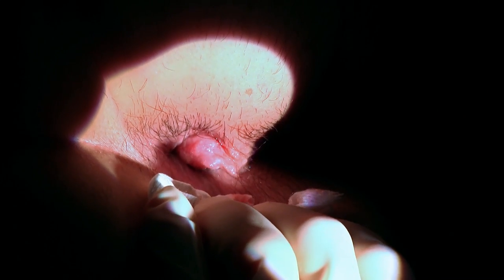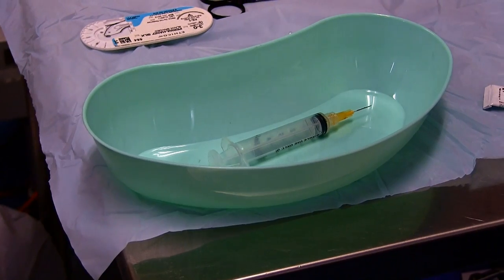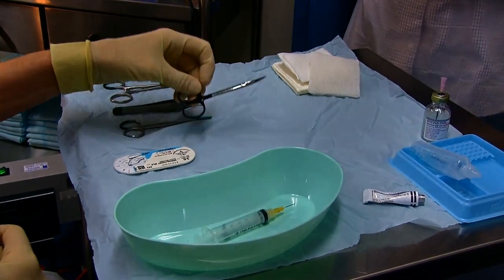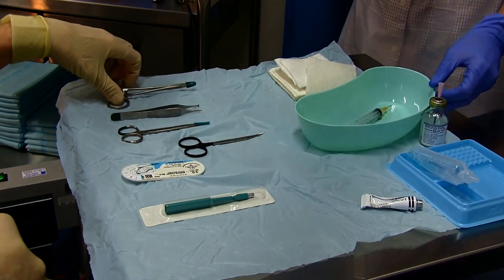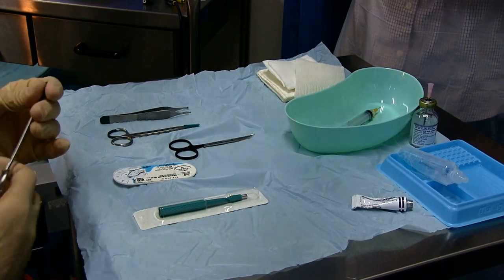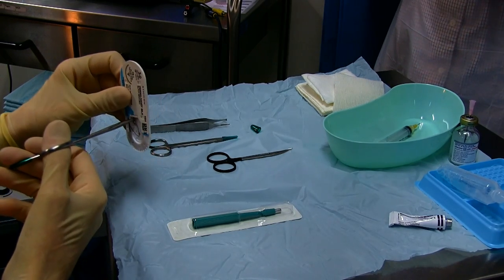We'll leave that for about a minute. While we're waiting for that anesthetic to work, we'll check what instruments we have: toothed forceps, curved scissors, and a 3-0 suture. We will not be using the punch biopsy on this occasion because the curved scissors will get a more representative biopsy.